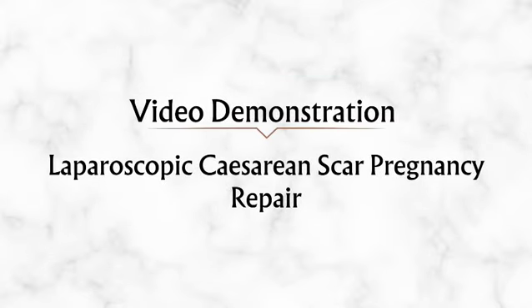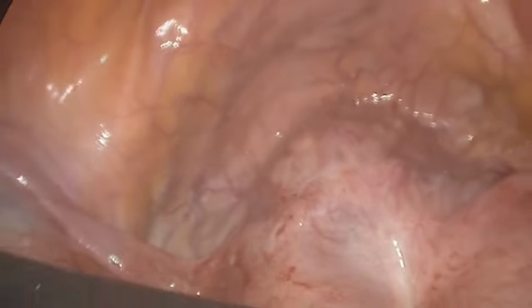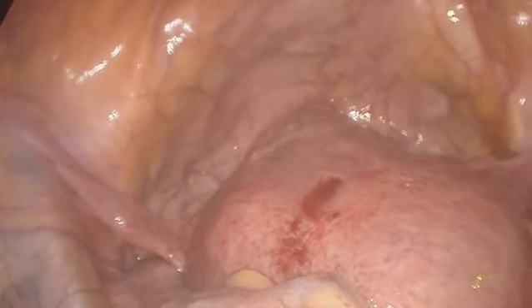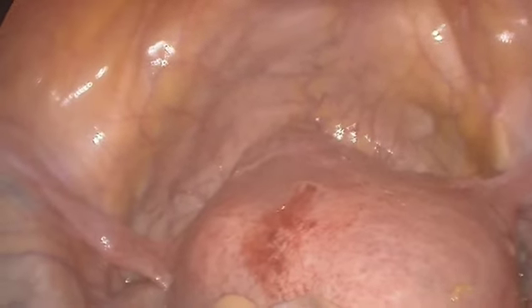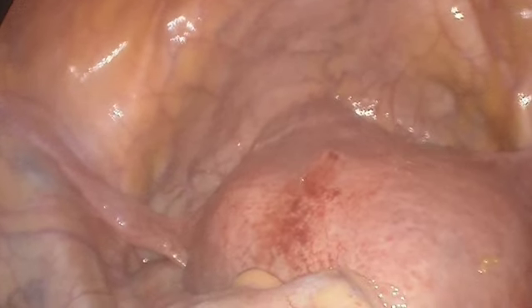Step 1. Here, we have the laparoscopic view of the pelvis. The uterus and adnexa look normal, but notice this additional bulge at the level of the previous caesarean section scar. This is the scar pregnancy, sitting just above the bladder. Always take time to orient yourself and identify the bladder before proceeding further.